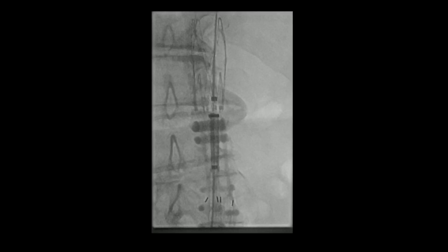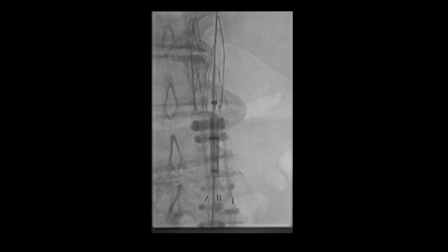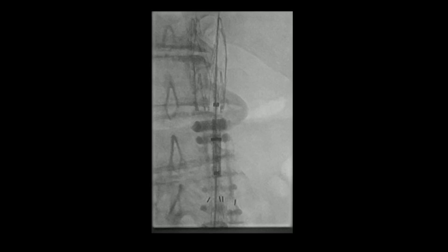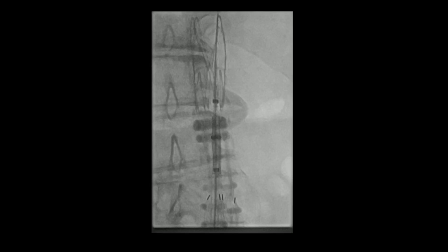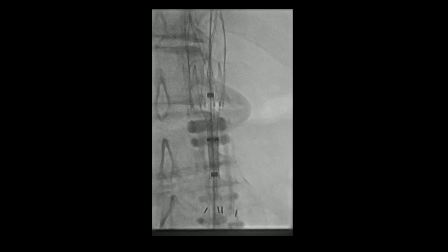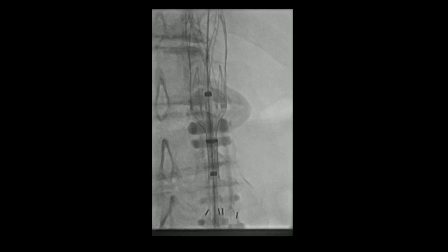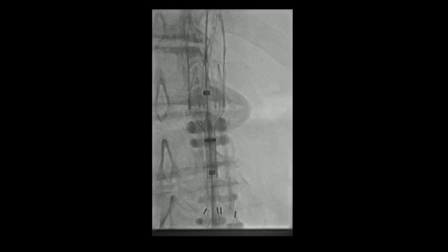With our stent in adequate position, we then withdraw the sheath partway and partially deploy the stent. This technique was described by the Ochsner group in a JVS article in 2008, which decreased the incidence of stent migration.